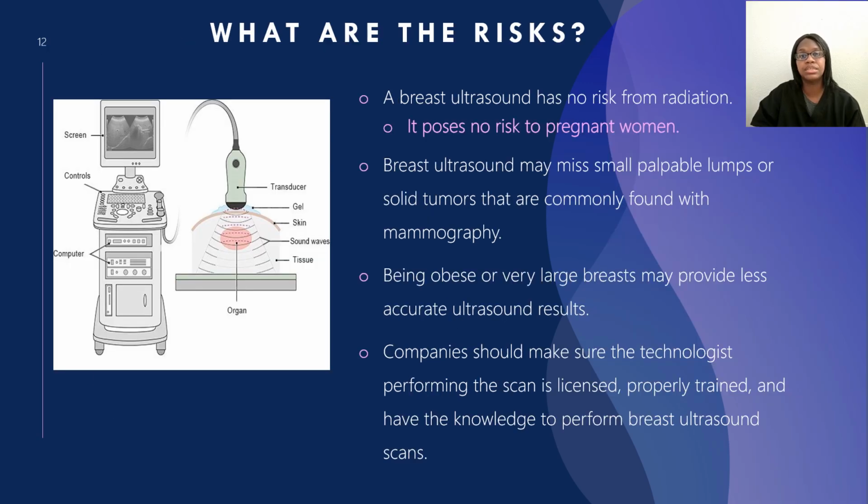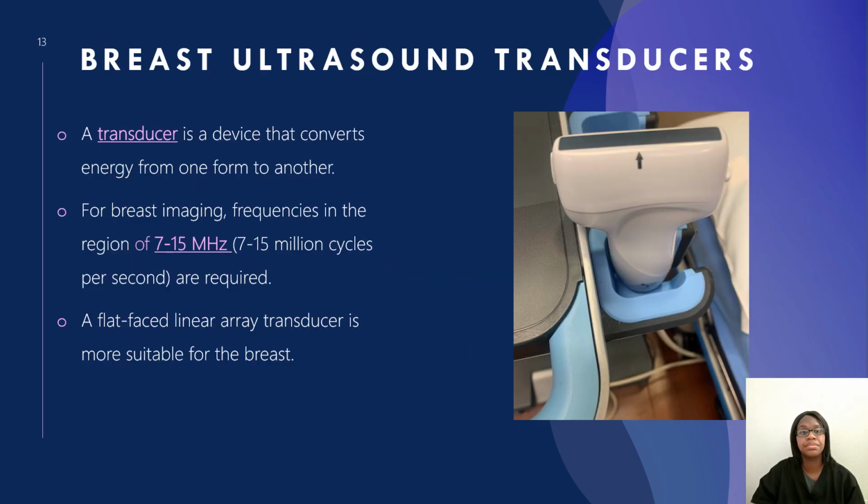With the risk with breast ultrasound, it doesn't have any risk from radiation because it doesn't use radiation. Therefore, it does not pose any risk to pregnant women. It may or could miss palpable lumps or solid tumors that are commonly found with mammography. If you have a patient that is obese or has very large breasts, then it may not provide as accurate ultrasound results. And then companies need to make sure that their technologist is licensed or properly trained to perform the breast ultrasound scan.